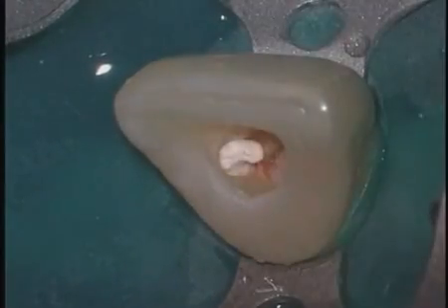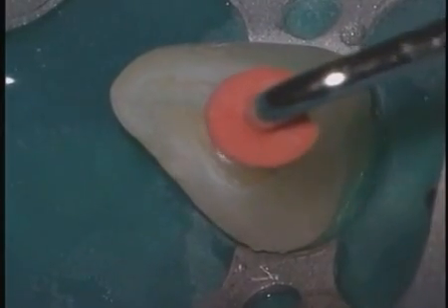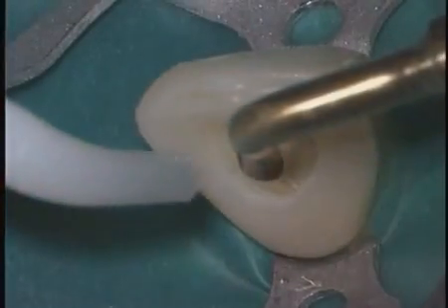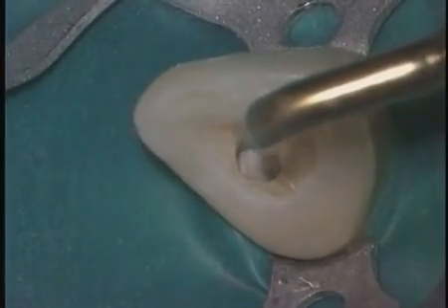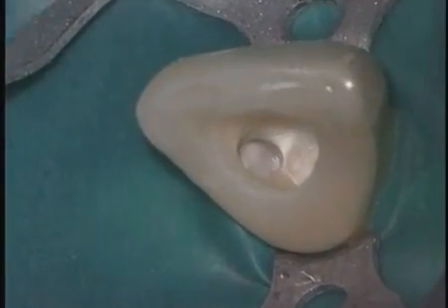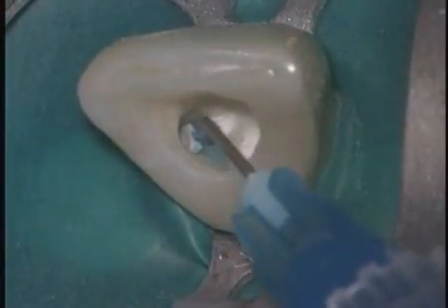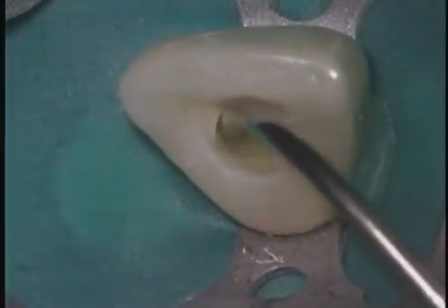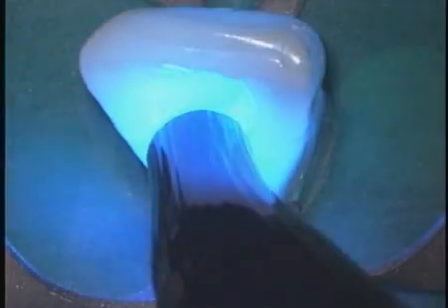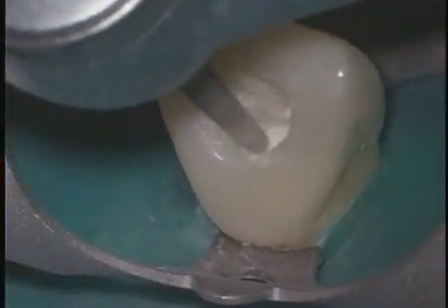Progressively add calcium sulfate, not only filling the entire osseous defect, but part of the tooth structure. Ultrasonics is an excellent tool to finish out the cavity preparation. We can use the principles of adhesion dentistry on an anterior tooth to repair perforation defects. We'll acid etch, and we'll use the principles of wet bonding. Additionally, use the bonding agent of your choice and light cure.